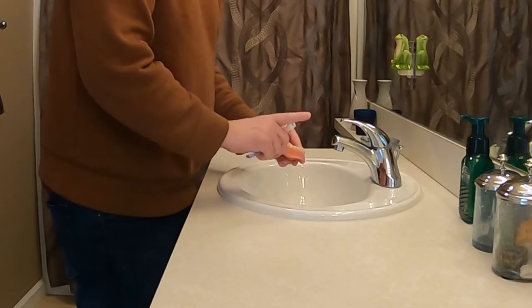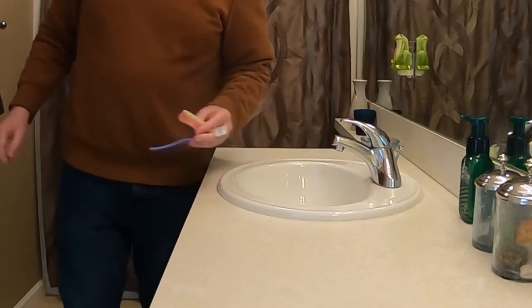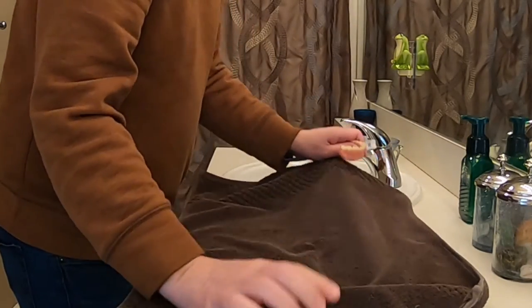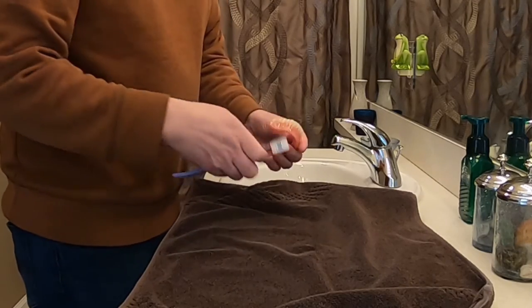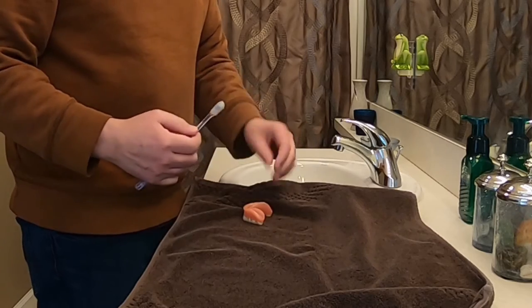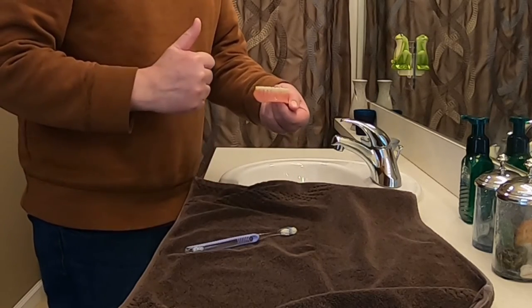One tip when cleaning your snap-in denture is to spread out a small towel on your bathroom counter and clean it over the towel. That way, if you happen to drop the denture, it won't break when it lands on the towel. I've had numerous patients chip or crack their dentures by dropping them into the sink or onto the tile floor in their bathrooms.